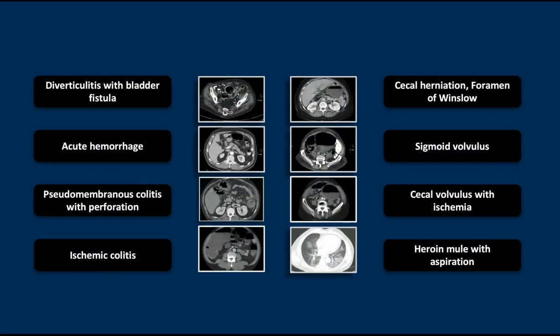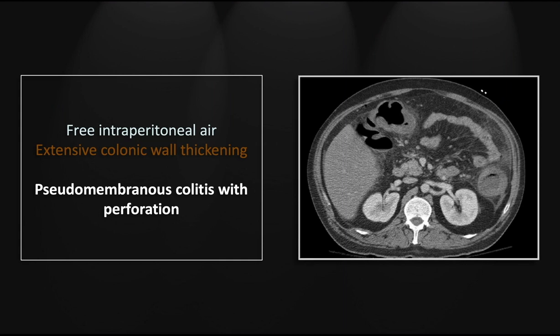Our next case is pseudomembranous colitis with an associated perforation. The perforations in these cases can be extremely subtle. That colonic wall gets markedly thickened and inflamed and loses all of its integrity, but it doesn't always frankly rupture. Often it's just a tiny leak that results in these small intraperitoneal foci of gas. There is extensive wall thickening throughout the entire colon, and it is that extensive involvement that specifically suggests pseudomembranous colitis as the cause.